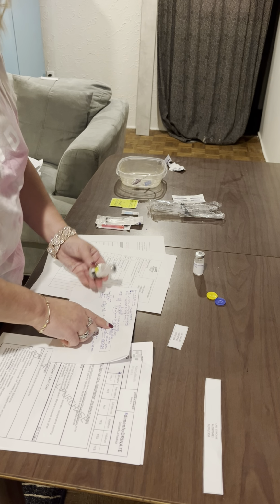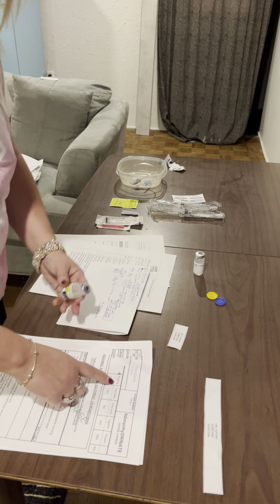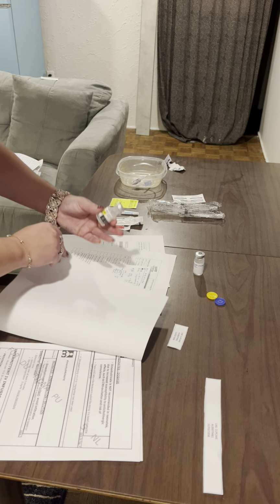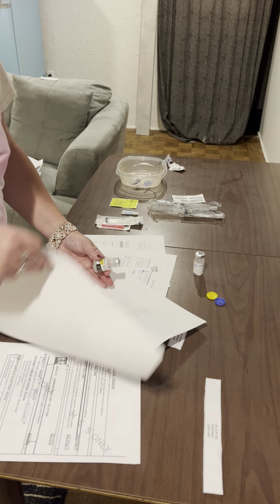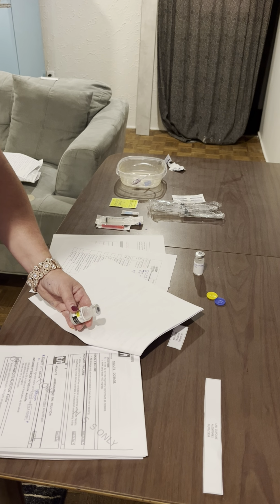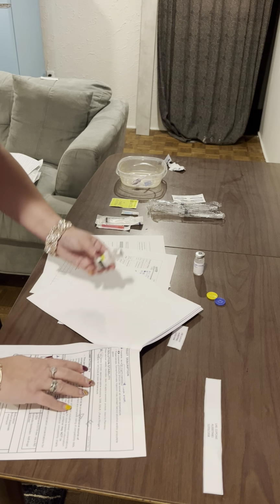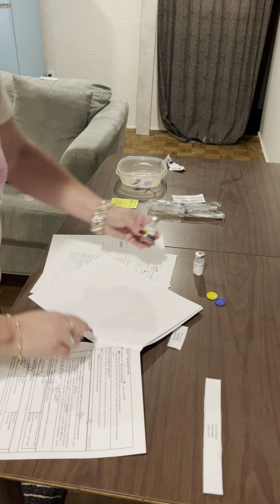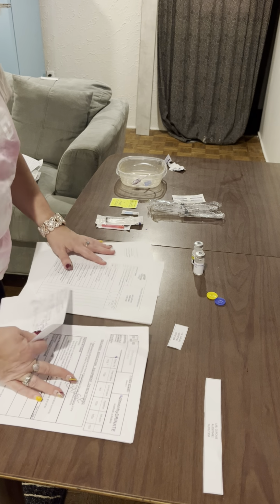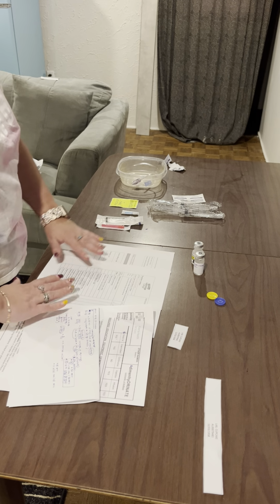And we are using normal saline as a diluent, so that's great. We will also check that with our monograph and see where it says for diluent. So here it is, IV solution stability, normal saline. Okay. So great, we have the right drug, and we have the caps off.